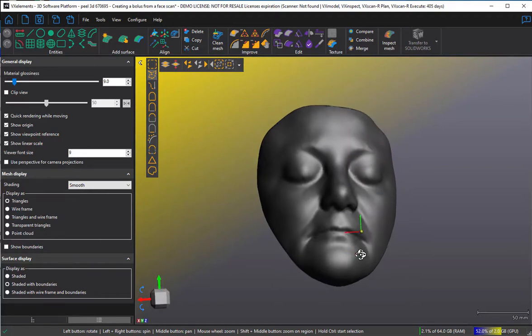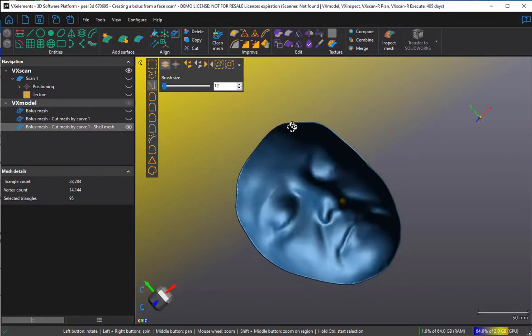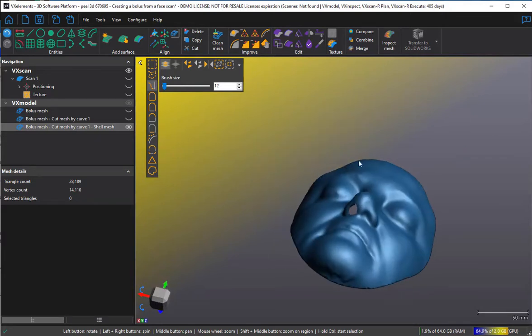You'll probably want to cut at least breathing holes. I'm going to use the brush tool and choose the select-through function to cut. You hold down the control key and cut roughly that size — I'll reduce my brush size to make the holes a bit smaller. That selects triangles on both sides; if we look through, the selection is on the inside as well. I just choose delete. And I'll do another cut here with my brush — control, delete.